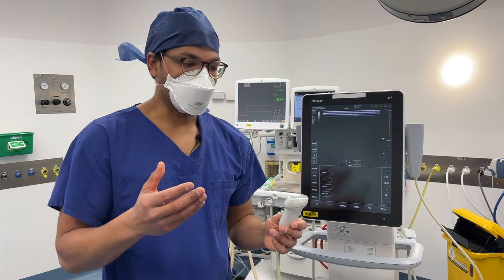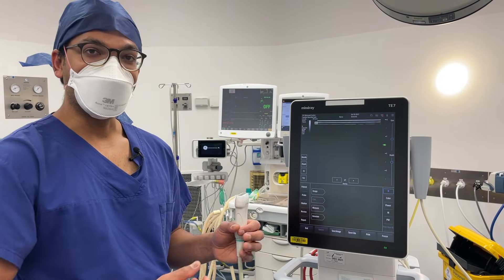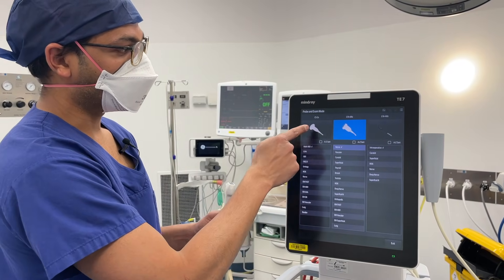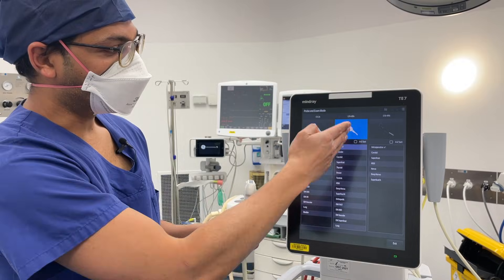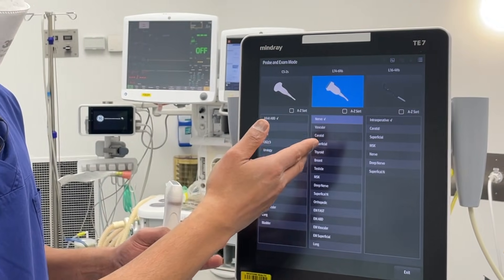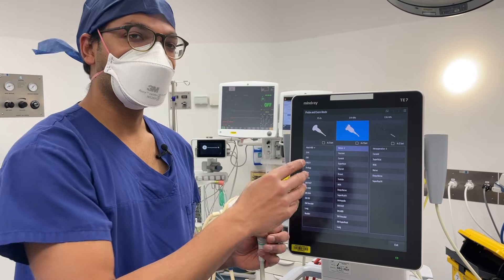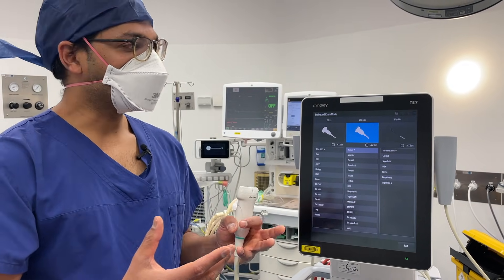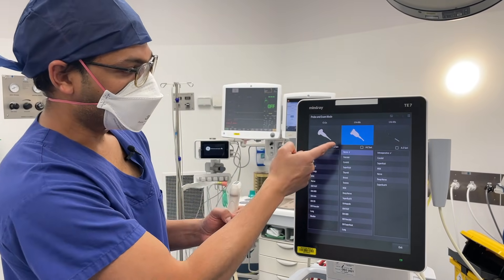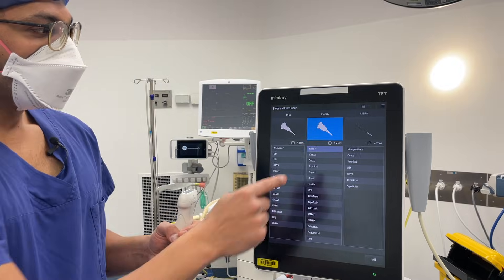The frequency is already preset on these probes, which is important. Sometimes the probe preset is chosen automatically based on which probe you plug into the machine; other times you press a button to select it. Presets might be in a different menu depending on the machine, but essentially they're preset algorithms that optimize your picture for whatever you need — nerve, vascular, carotid, superficial — whatever it is. Let's go to the vascular preset.